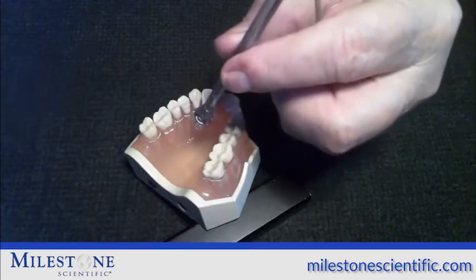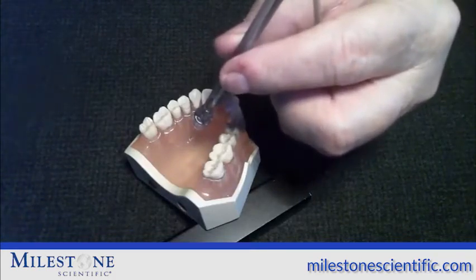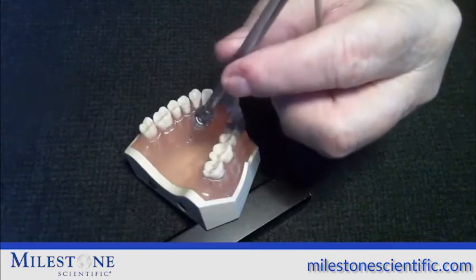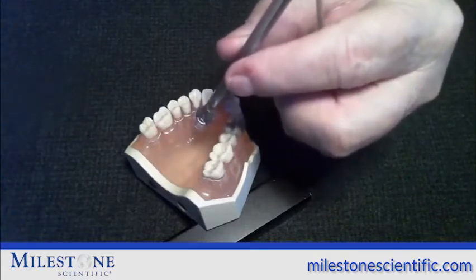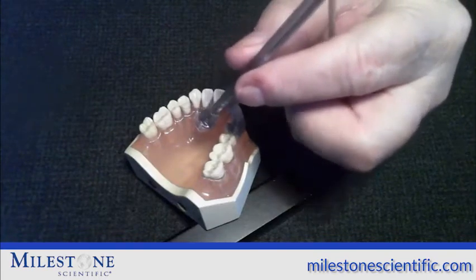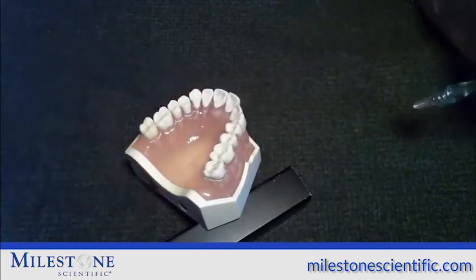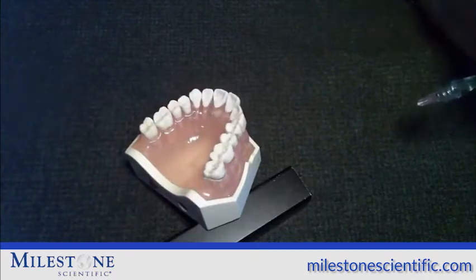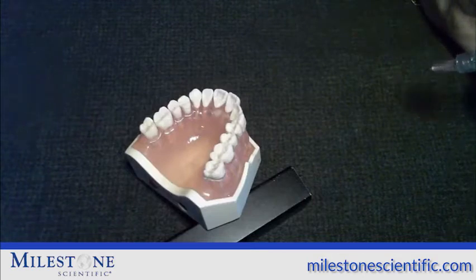So using lidocaine on a child patient, use no more than half a cartridge. When you've delivered as much anesthetic as you need, enter into aspiration by hitting the foot pedal, releasing it, and in the middle of aspiration — which is about six beeps — after the third beep, take the needle directly out of the mouth and hold it away from the patient or put it on the patient's bib. The injection duration is about an hour and a half approximately, usually more, and the onset of the anesthetic is usually within a minute or two.